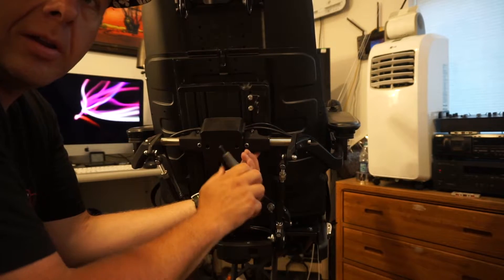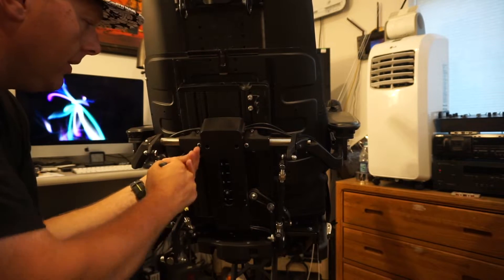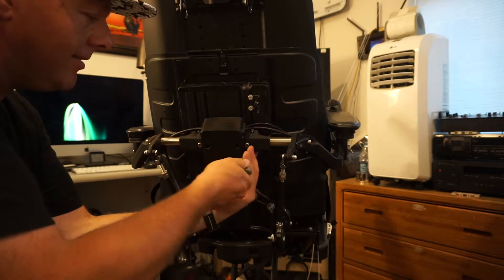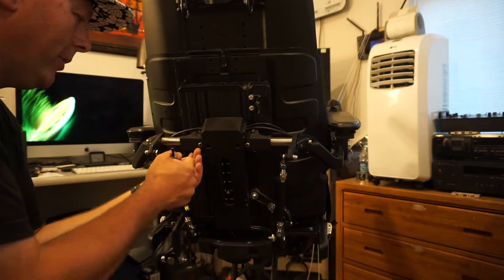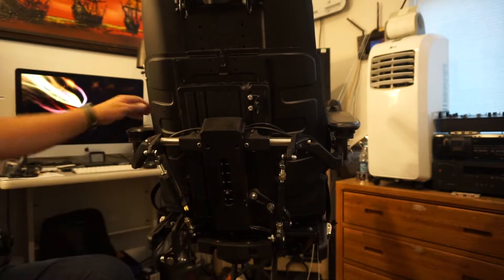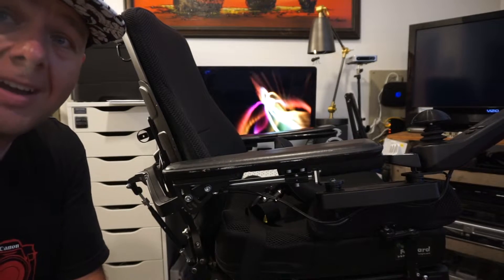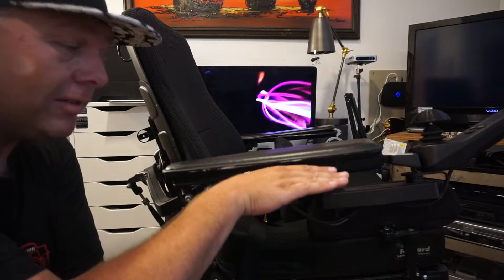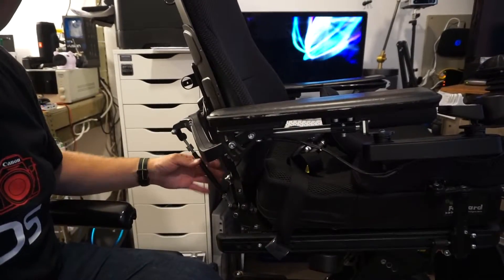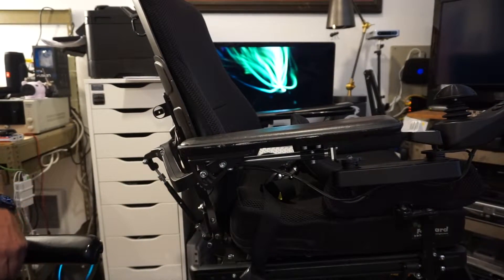You don't want to tighten them all at once as tight as they'll go. Just go around in a couple of laps and tighten them down as you go, just to make sure if things are binding you're not going to break stuff. Now you can see everything's good and solid again — they don't move around. Now that our height has been adjusted, no doubt the angle of these things is not going to be correct, and that's where twisting these turnbuckles on the back is going to adjust them.